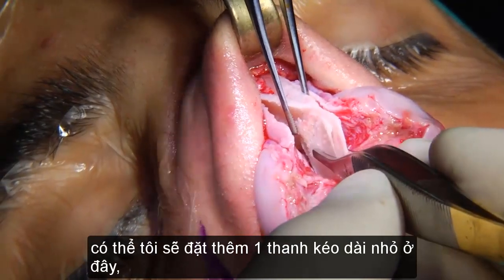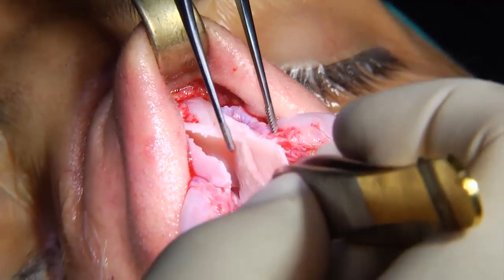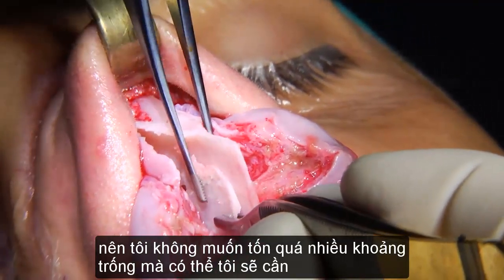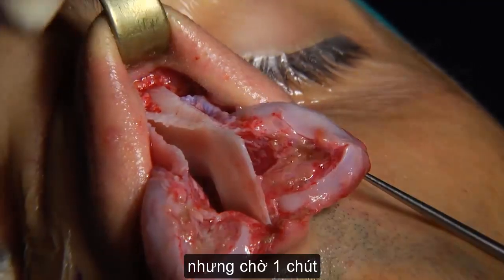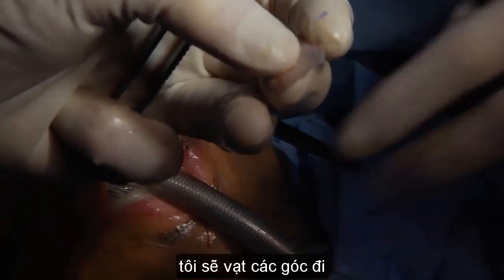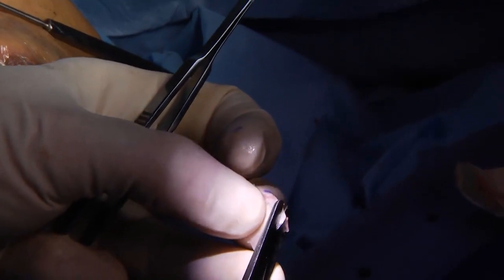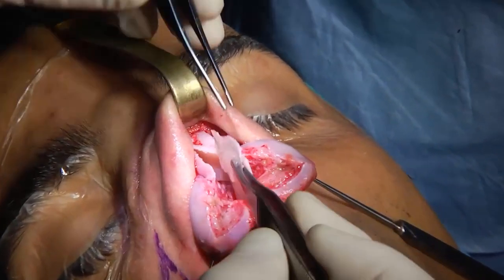Maybe I will put a small spreader here, so I don't want to get into a space which I may need. So essentially, I will do this, but scissors. I can just do this. That's probably more than enough.